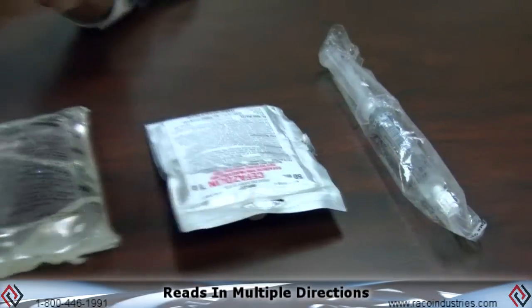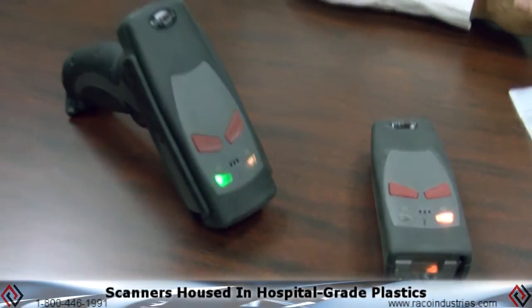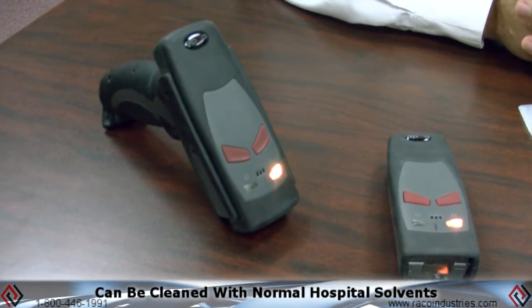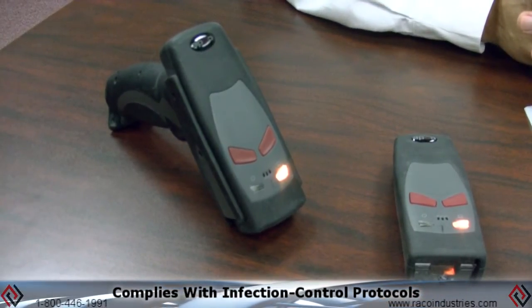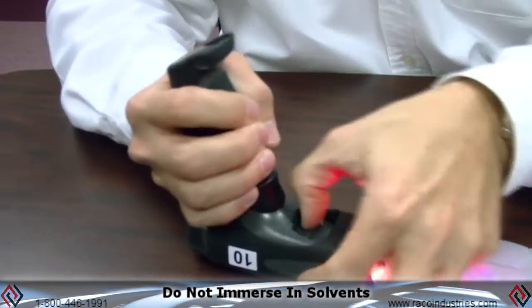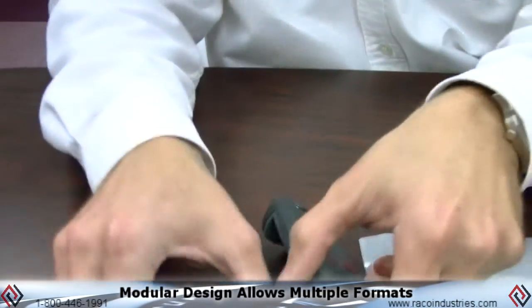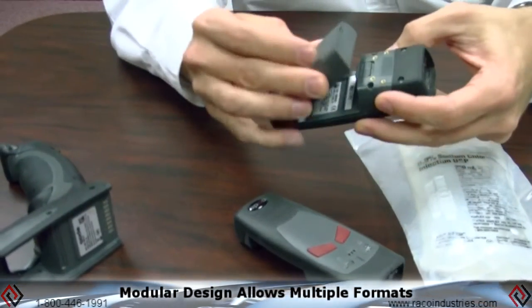It'll quickly read and it doesn't matter which direction you orient it. The scanners are built with hospital-grade plastic so they can be cleaned with any of the solvents you're normally using in a hospital to disinfect with your infection control protocols — washed three or four times a day, whatever is needed. As long as you're not immersing them, it's fine. What's also special is that it's very modular, so the same unit can go from a battery handle to a simple palm format by switching out the batteries.